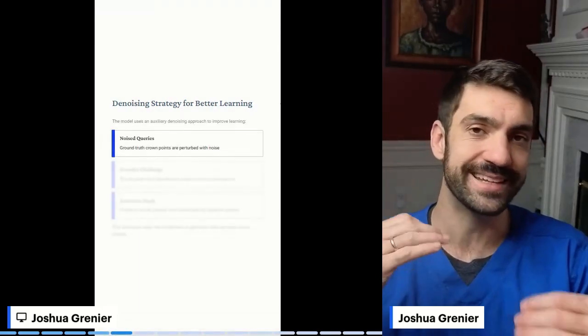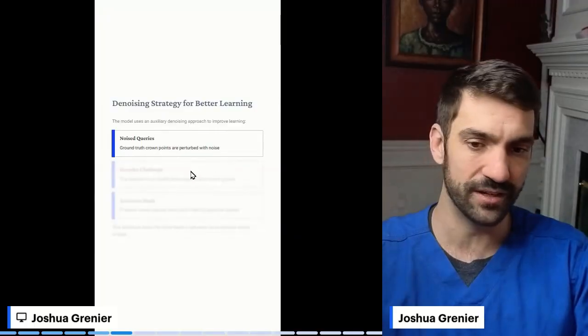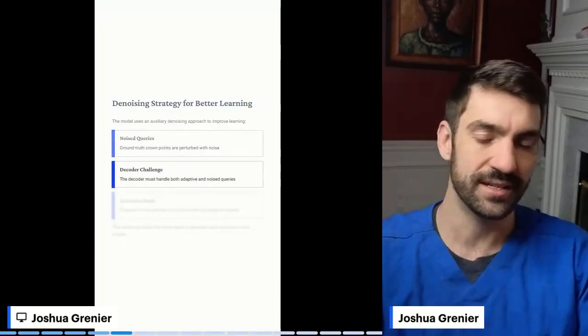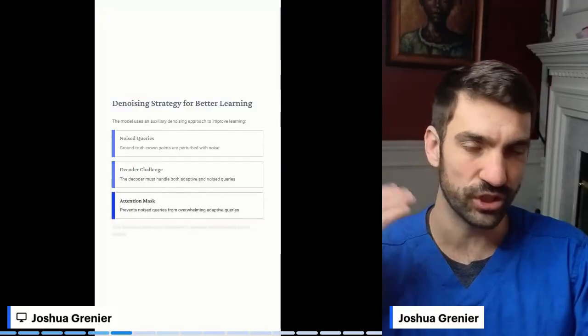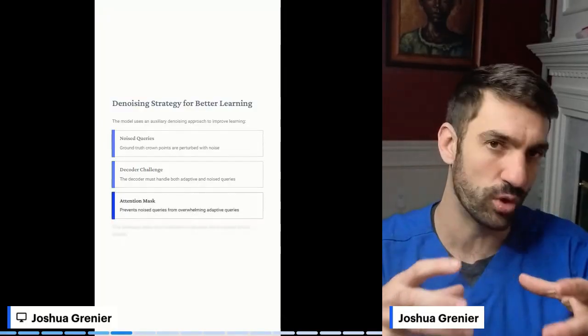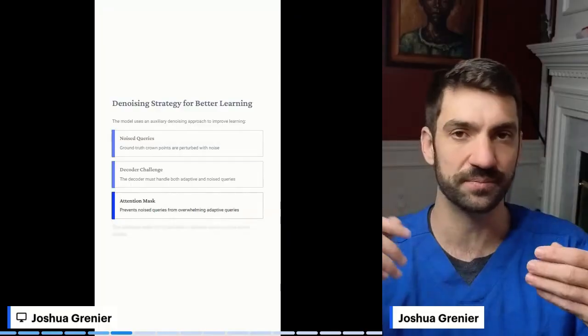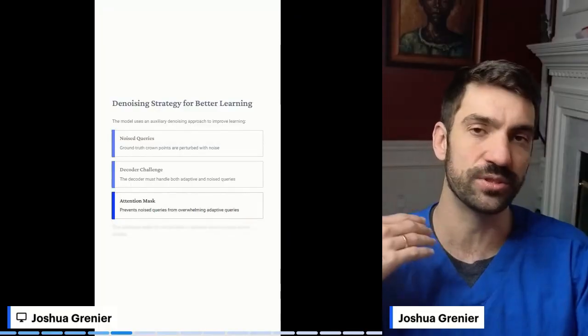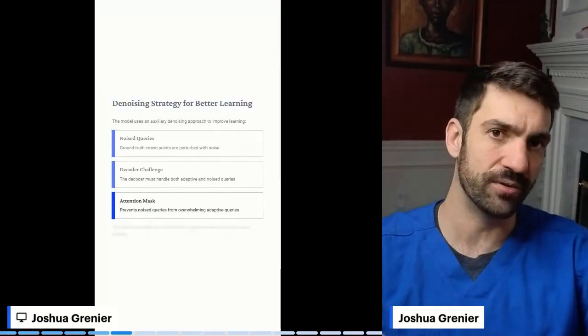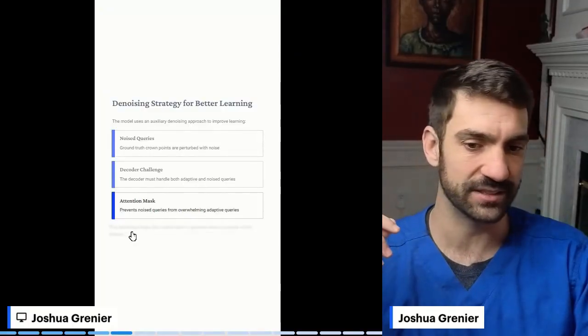The problem with this was getting good data. They used various options where they added noise to the crowns just to try to increase the amount of learning. If you only train it on just a few, it'll essentially just memorize what those crowns are. And when you give it something new, it'll give you something crazy. So that is really the problem. So they use various tricks to try to increase and stretch out and thin out the amount of data they actually have.